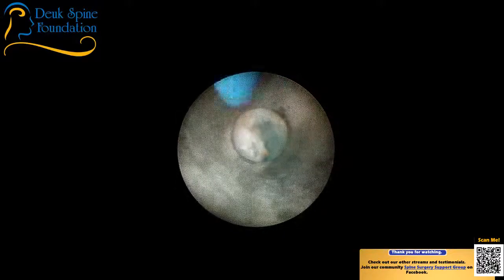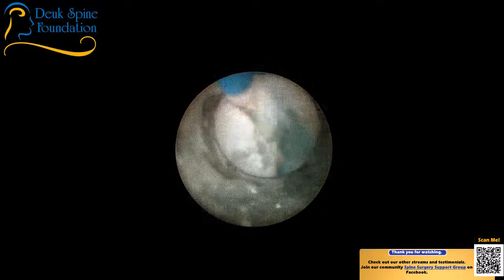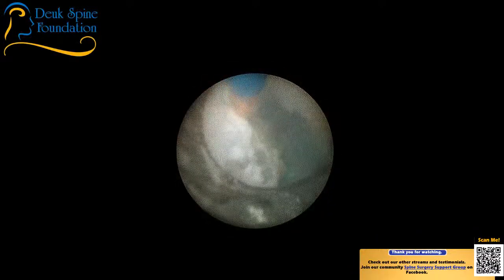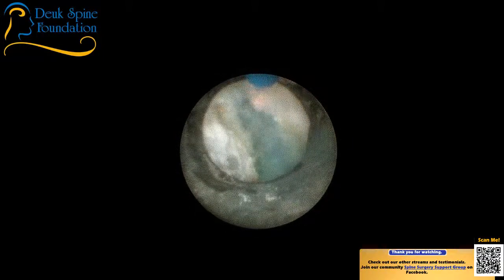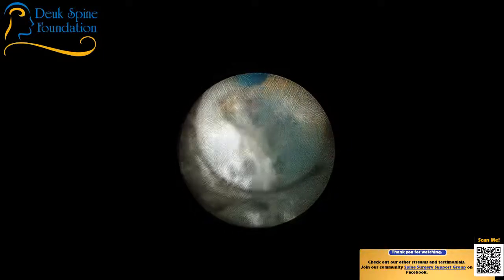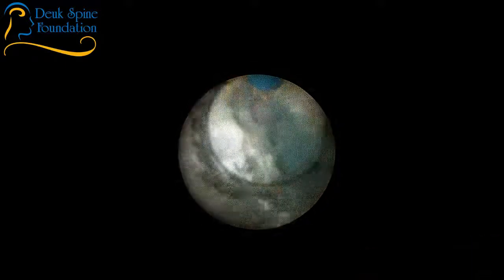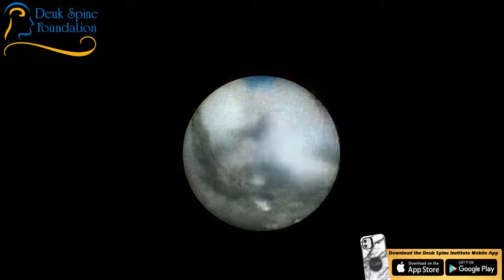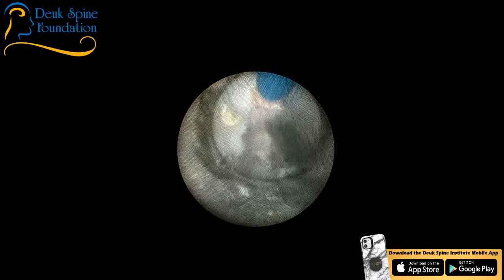If they don't reattach, then you have an opening there that will stay there, and the patient can get another herniated disc very easily. So the key to my surgery is to debride the annular tear, clean it up so that it's able to heal. If you don't debride the annular tear, it won't heal. If it doesn't heal, then another herniation can come back.